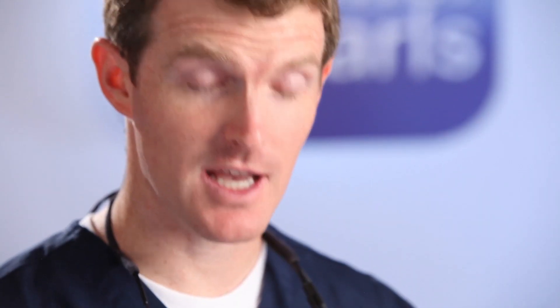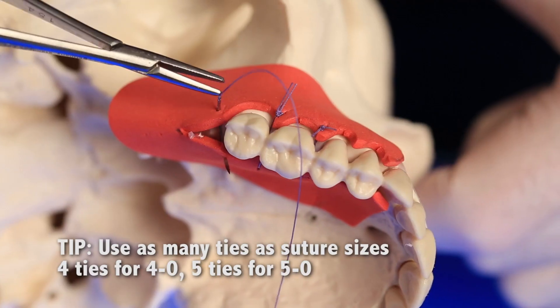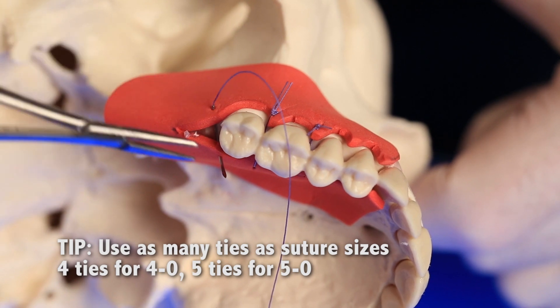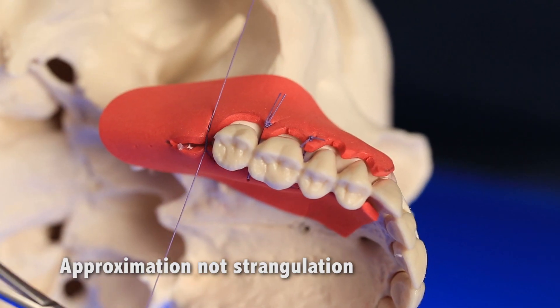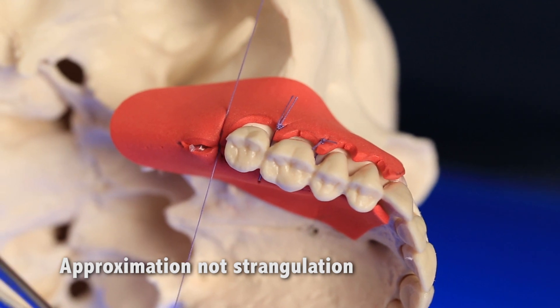Number nine, how many ties do you need? Our rule is to use the same number of ties as the suture size: four for 4-0, five for 5-0, etc. Number ten, don't over-tighten suture. If the tissue is turning white under the suture, the flap may suffer ischemia.